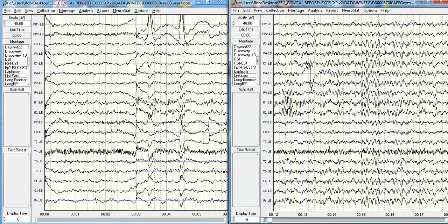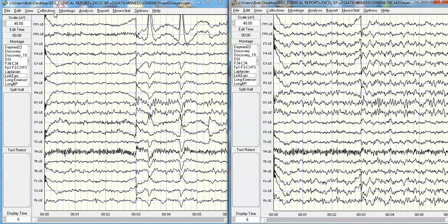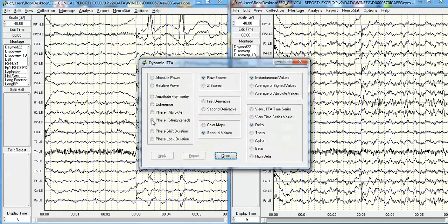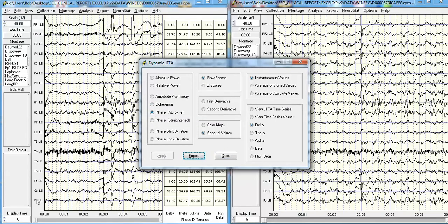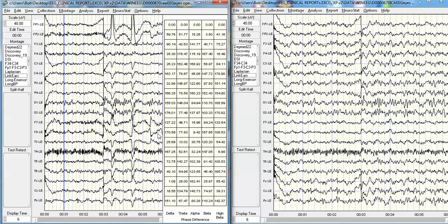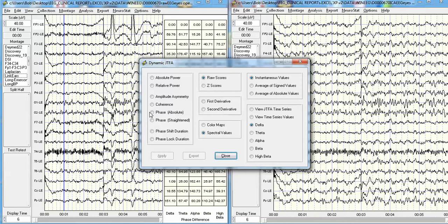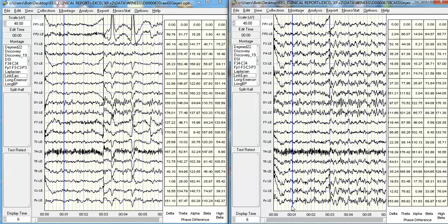I'm going to click Home and go back to the beginning of this record and look at what happens with phase differences. We click View, then Dynamic Joint Time Frequency Analysis, to look at the phase differences for the spectral values. I'm going to select a point in time — exactly at one minute — and you can see the phase differences between FP1 and the remainder of the record. I'll do the same on the other side: select the phase differences, apply, close, and select exactly one minute — the same point in time. Here are delta, theta, alpha, beta, and high beta phase differences. Every one of these phase differences is different from the phase differences on the other side.